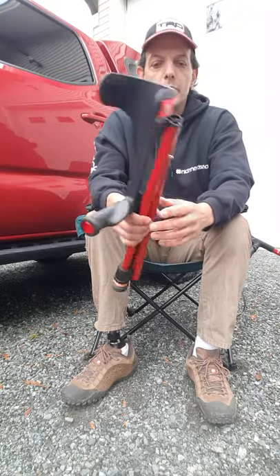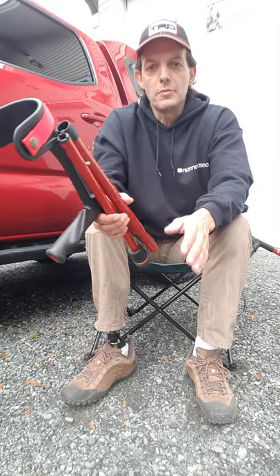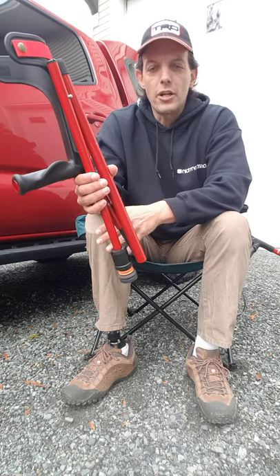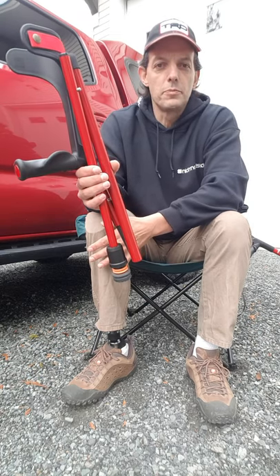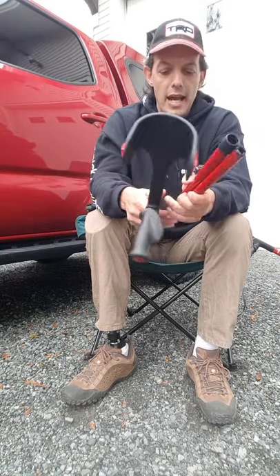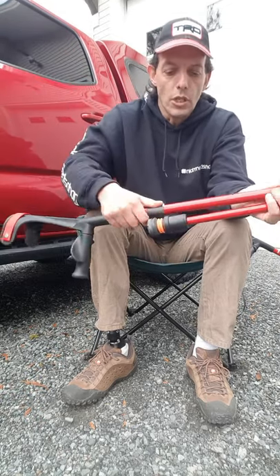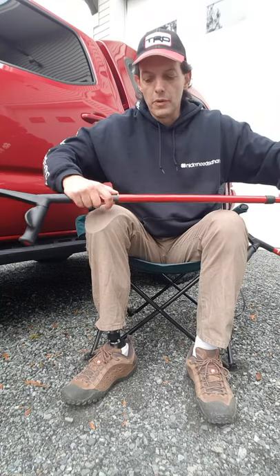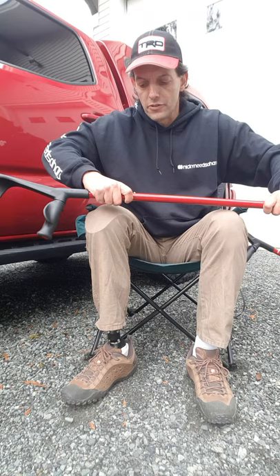When folded like this, they easily fit into my backpack so I can bring them along on a hike. Because I'm still a relatively new amputee, I'm not sure how my leg will respond to different conditions out on a hike, so I like to have these crutches along as a backup. They're going to be traveling with me on all my adventures from now on.